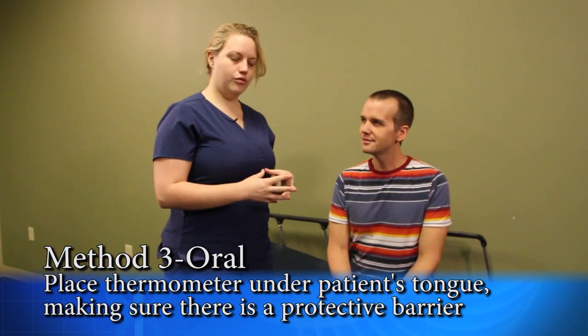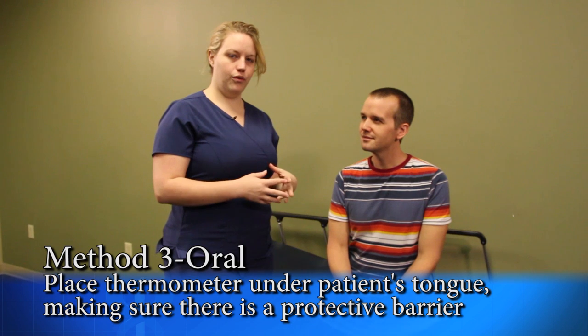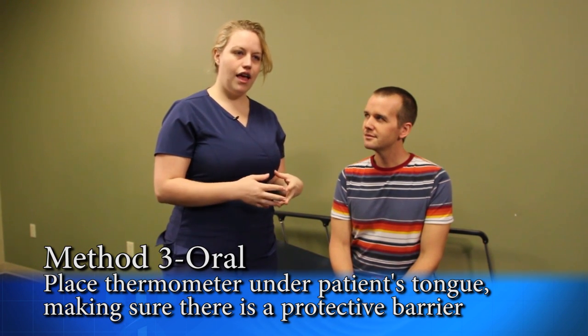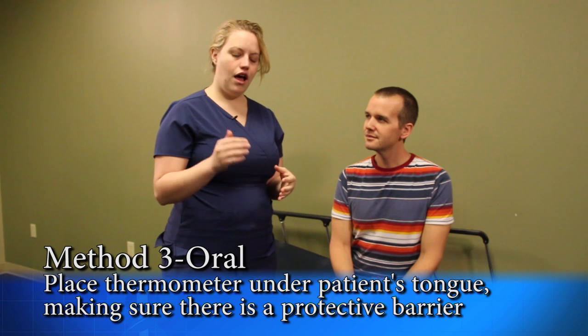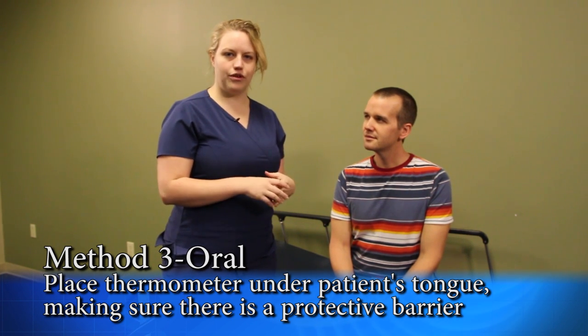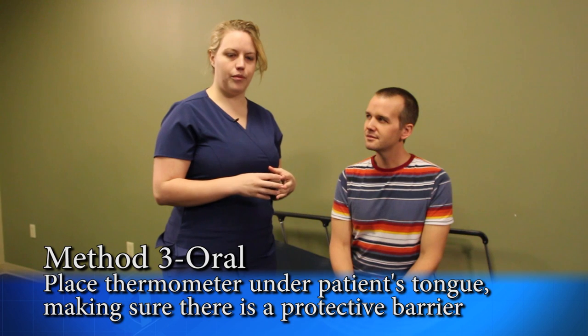Another option is the oral temperature, where you'll ask the patient to raise his tongue and place the thermometer underneath the tongue. Make sure that there is a protective barrier on the thermometer.